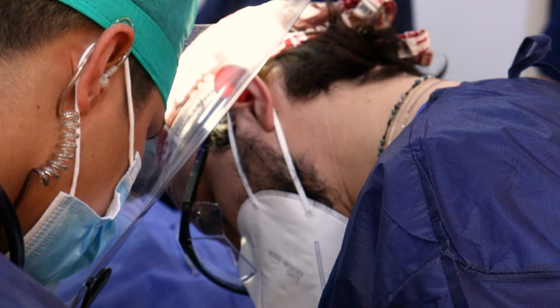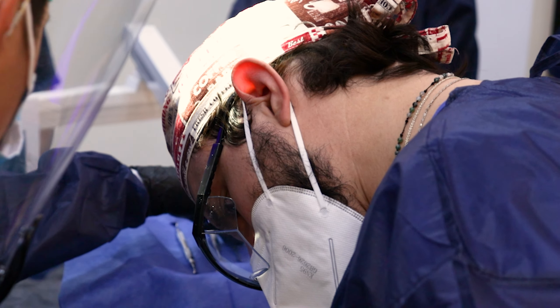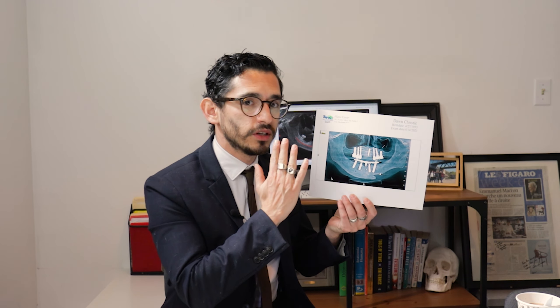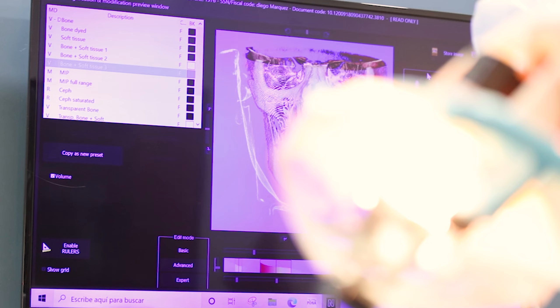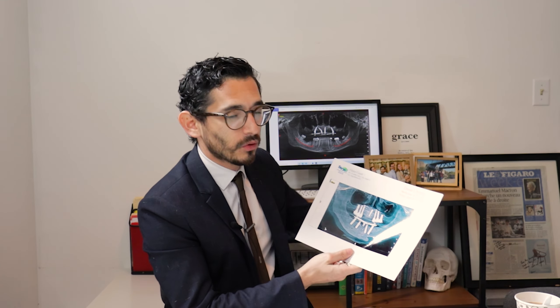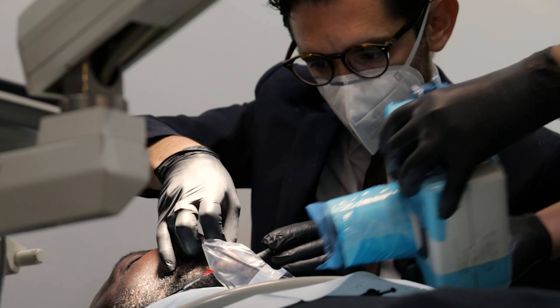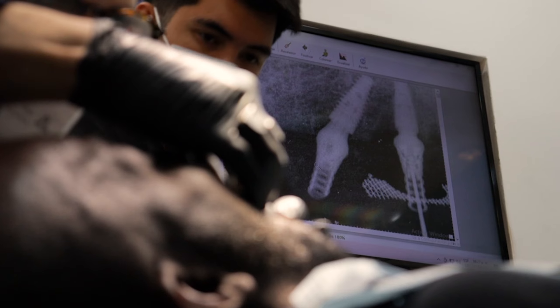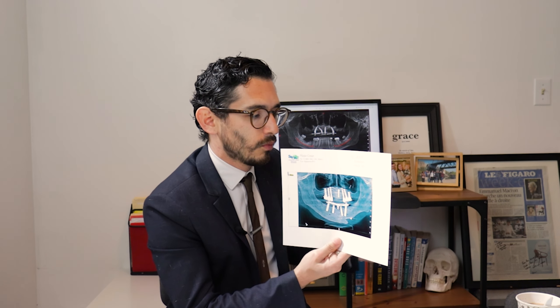A CT scan is a tool that we use a lot in implant dentistry, for root canals, and for general checkups. We can analyze an image in one dimension as a picture or a normal x-ray — this is a panoramic x-ray, for example — but what we want to see is what's inside the thickness of the bone, inside the tooth, where the canals of a nerve go.